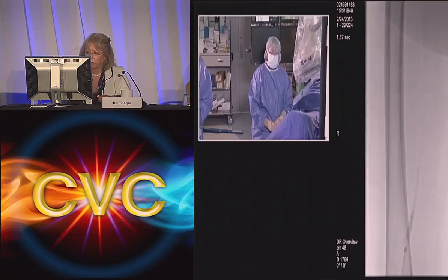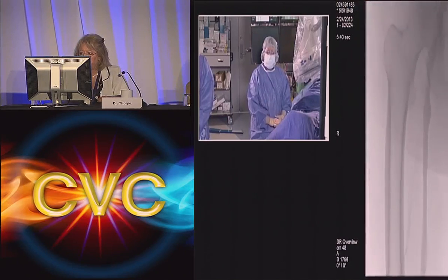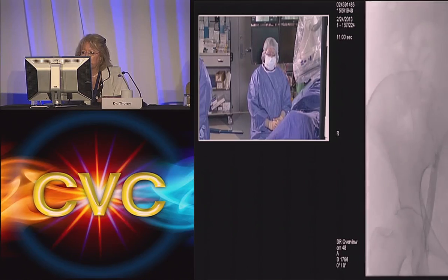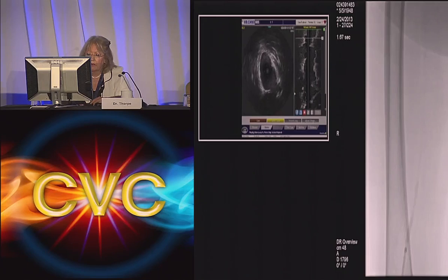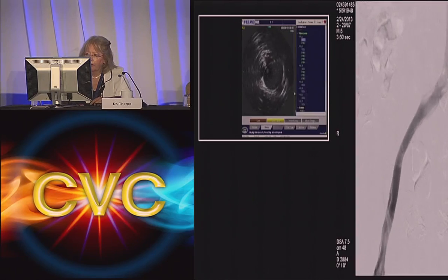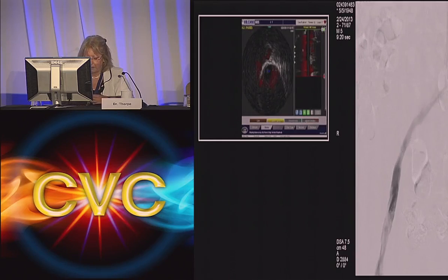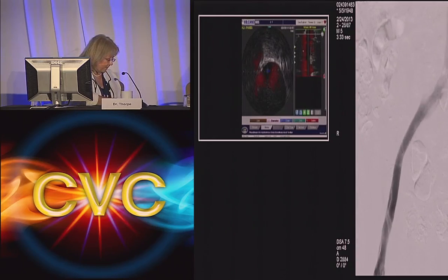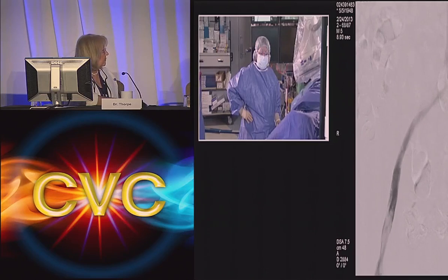The first venogram shows that the femoral vein looks good, but on the ultrasound itself, there was some non-phasic flow in the external iliac. So that suggests there's a proximal obstruction. And on the digital subtraction of the iliac, you can see that it looks darn good. There is an area that's somewhat low density near the common iliac, but the telltale sign is that there is stasis of contrast in the external iliac area and a little bit of a filling defect, which we can see then again on IVUS.